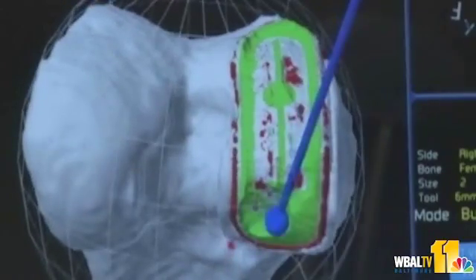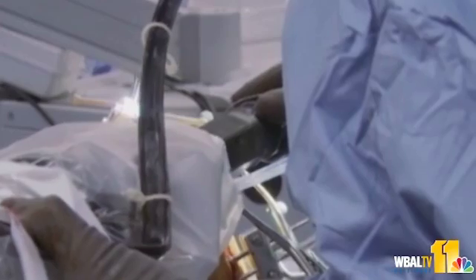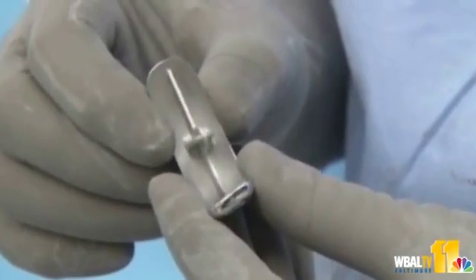Doctors perform Makoplasty using a robotic arm that contains a three-dimensional model of the patient's knee. Using that information, the Mako robot resurfaces the diseased area of the knee and replaces it with precisely placed implants.